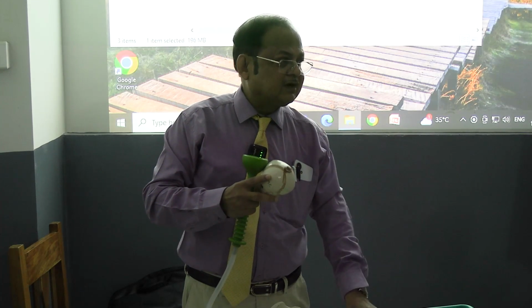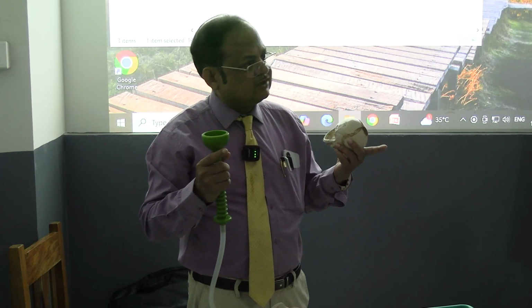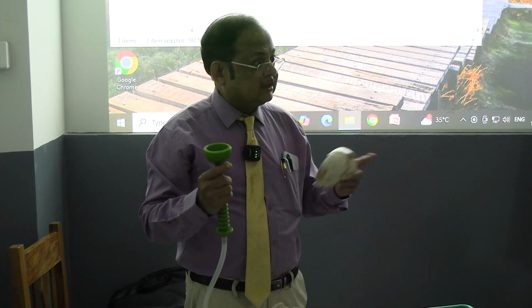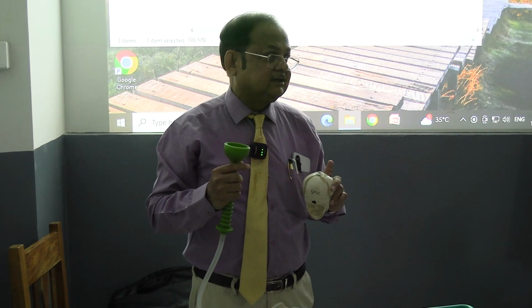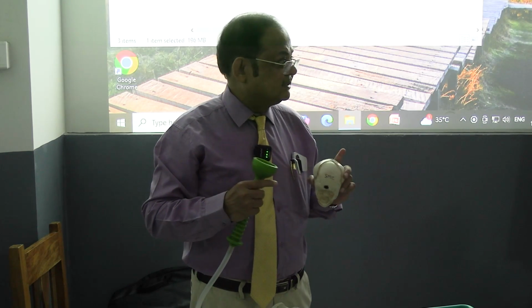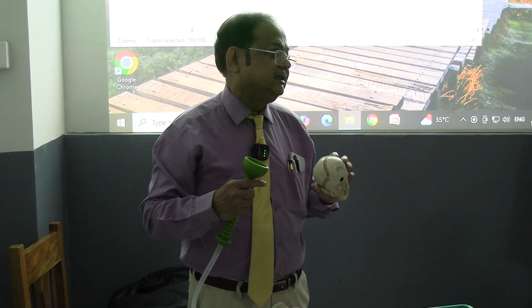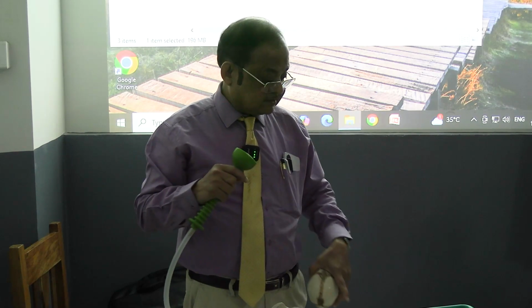The most important contraindication is a small baby, a premature baby, because there is more chance of intracranial hemorrhage and damage to the fetus. So for a small baby you cannot use ventouse, but you can use forceps. That's the advantage of the forceps.